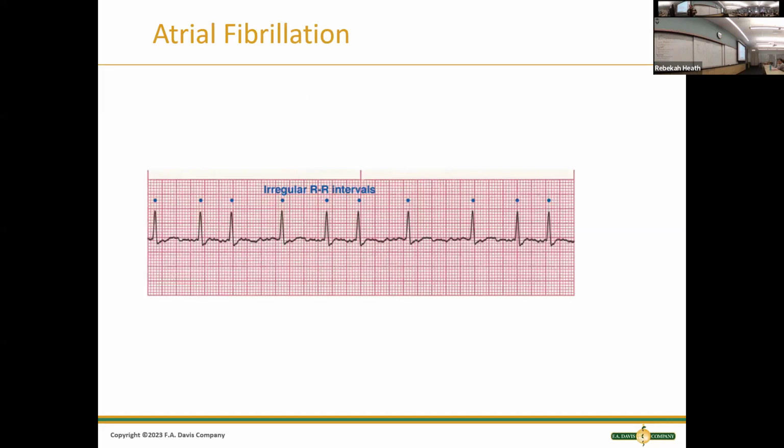All right, so atrial fibrillation. Looking at this, you can tell there's a big difference in these P waves compared to the atrial flutter waves. Look how tiny they are. When I think fib, it's hardly anything. They're not consistent, even the size of these little P waves, it's just like scribbles, right? And then when you're looking at the regularity, is it regular?